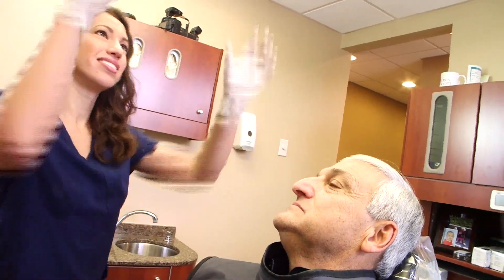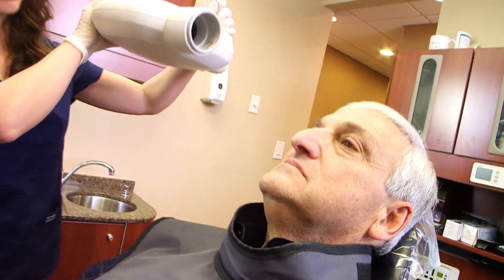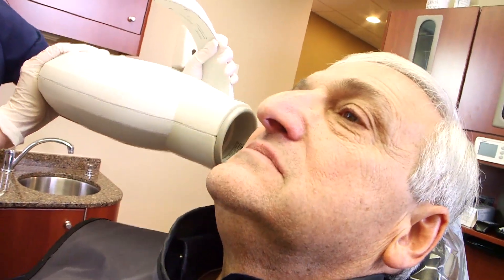The PSP sensors used with ScanX work with the same positioning device and x-ray system your office is currently using. ScanX PSP sensors are paper-thin, flexible, reusable, and best of all, wireless.